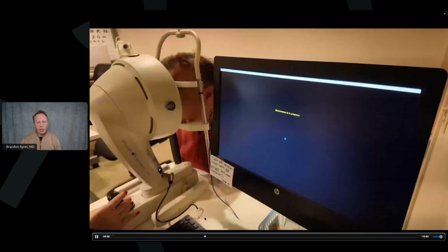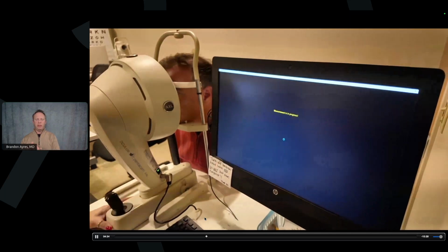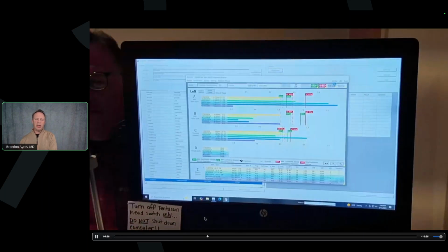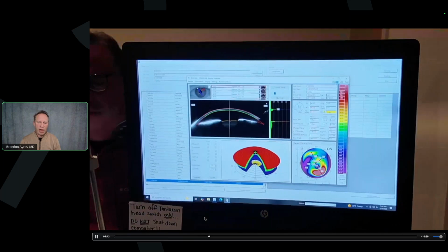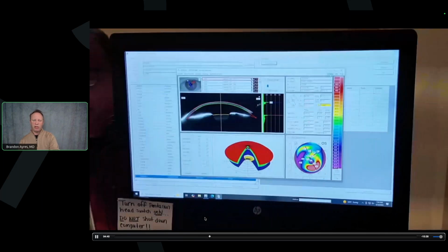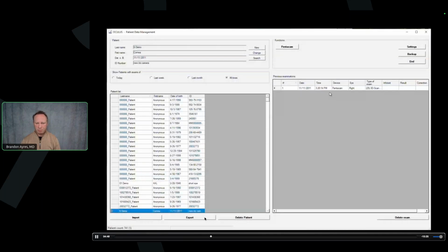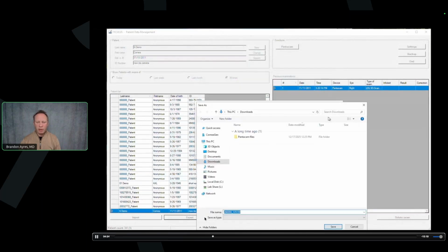We're going to get our imaging, and the Pentacam is going to be used, put through the nomogram, to design our CTAK segment. But you can just see my technician grabbing the scan. You can see on the image there, this patient definitely has keratoconus. You can see it in the image. This is a fellow who I've actually seen quite a while.